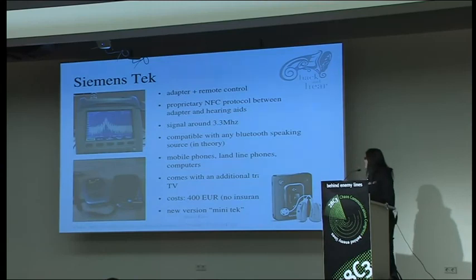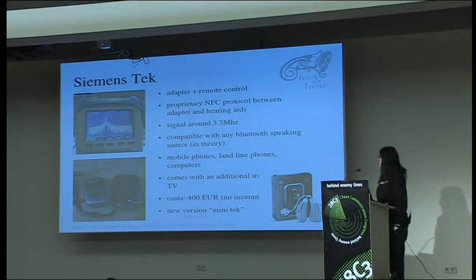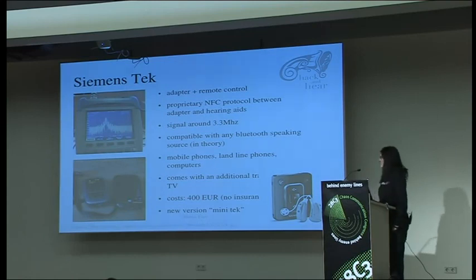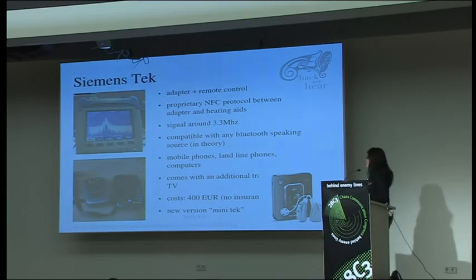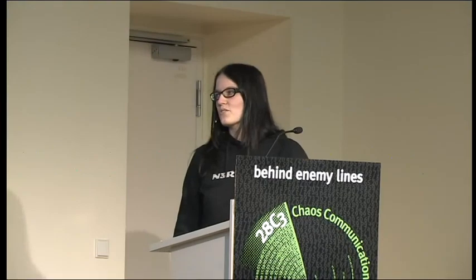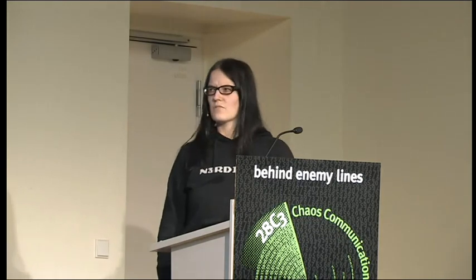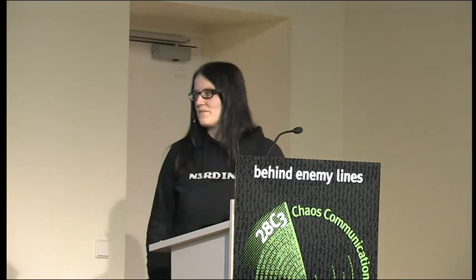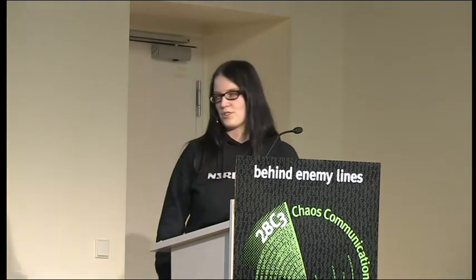I tried that. And it's compatible with every Bluetooth speaking device, in theory. Practically, you have to check it with everything. So whenever I get a phone at work or whatever, I have to check if it actually works. Of course, it works best with Siemens mobile phones, but you can imagine how old they are. They are also supposed to work with landline phones, but on their website, they say only two, I think only two Siemens landline phones, of course. Other than that, they don't guarantee that it works.